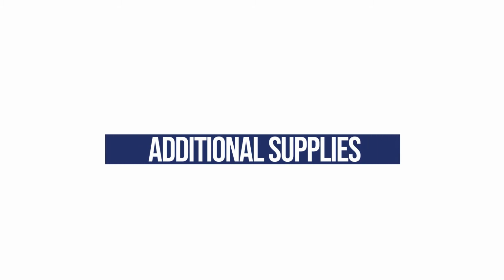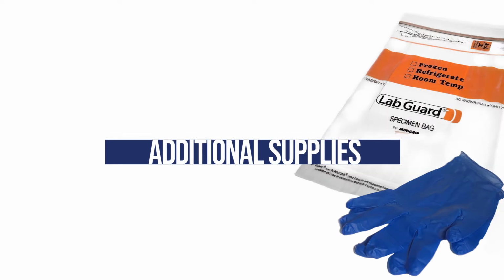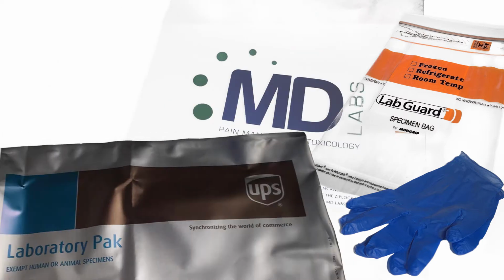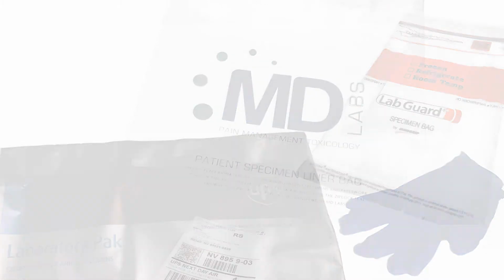The other supplies you will need for safe and proper specimen collection and transport include gloves, plastic biohazard bag with absorbent pad, MD Labs liner bag, UPS or FedEx lab pack with a pre-affixed MD Labs return label. All of these items are provided free of charge by MD Labs.